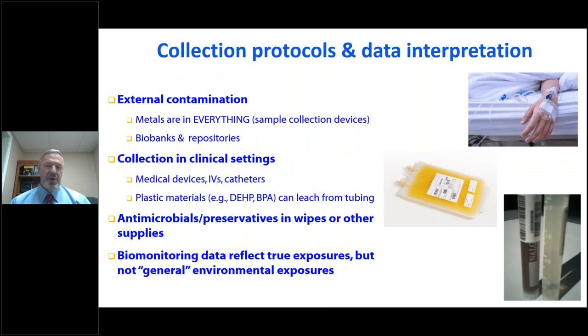So some of the issues with biomonitoring is the collection protocols. External contamination is a huge deal, at least in the metals world, and it is also in some of the other organic analytes, because metals are everywhere. They're in sample collection devices. They can be in the biobanks or repositories.